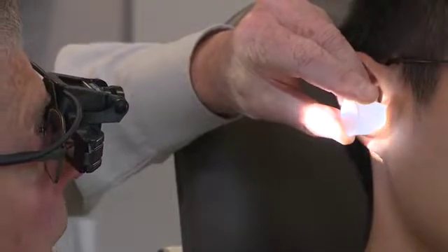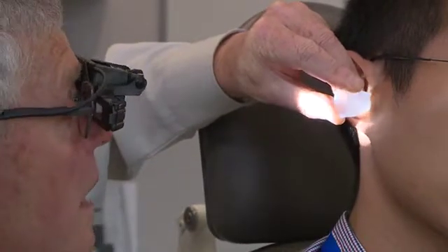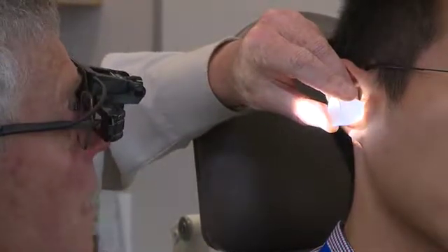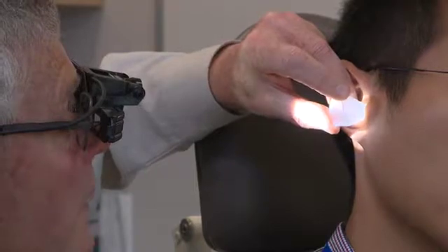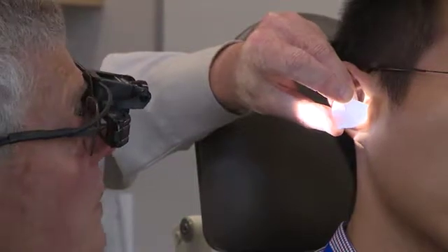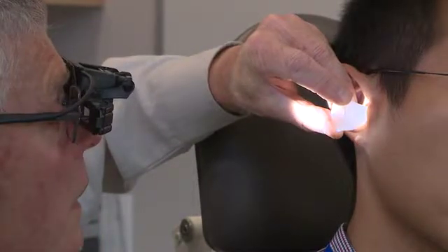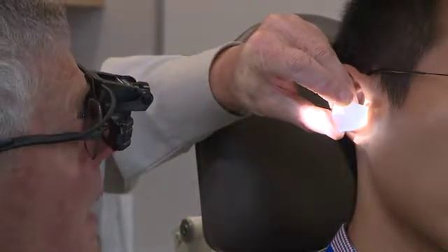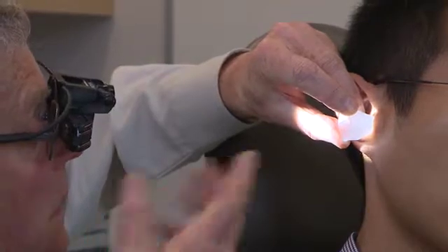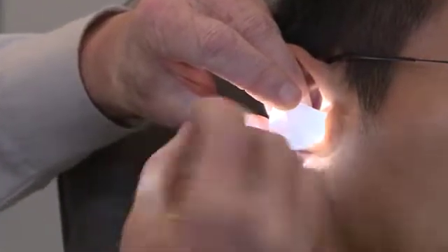A really useful bit of knowledge that took me a long time to acquire was how far in is the optimal distance. If you go past halfway, you'll be in the bony canal — you can't stretch that open, it's bone, and the skin's very thin so you can't compress it. So all you're going to do is cause pain — you stop short of that. But how do you know you've gone far enough? There's a wonderful landmark: the tiny hairs that you only find in the outer half. The eardrum itself has no hairs, and the same skin lines the deep canal. That's how you know you've got the right distance.